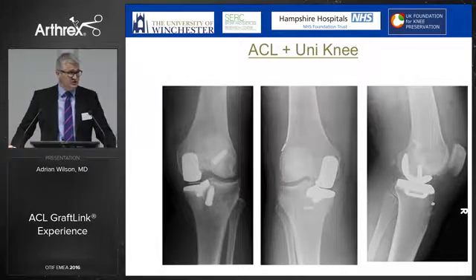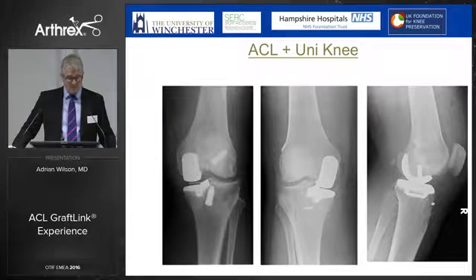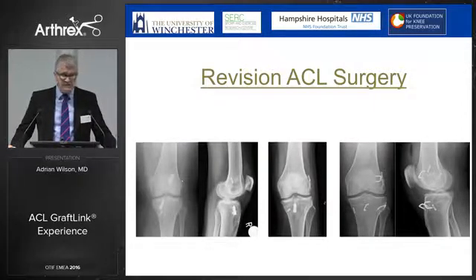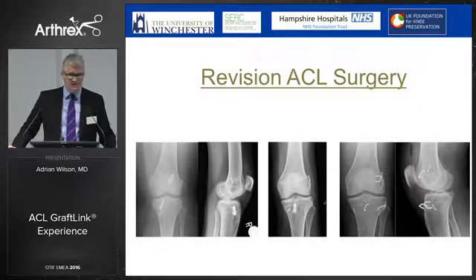What about additional procedures? So again, if you're doing complicated surgery such as an ACL and a uni, I think this lends itself very well and makes this procedure very, very much more straightforward. In the revision case, you can often completely ignore the existing hardware. You can position the flip cutter wherever you want, and you can navigate a new socket very easily without even thinking about the existing hardware, which makes these cases much more straightforward.